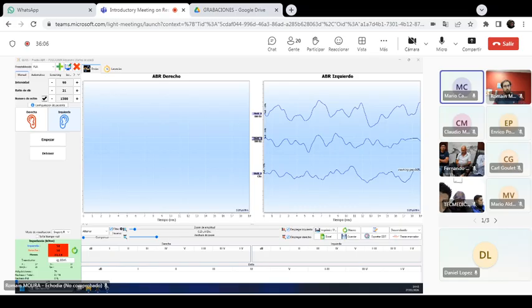But again, I would like to double check if the Commission really can ask for these features, because we are talking about a different type of unit, and I think there was no requirement for an audiometry test for this type of device. Again, correct me if I'm wrong, but this should be the approach, in my opinion.